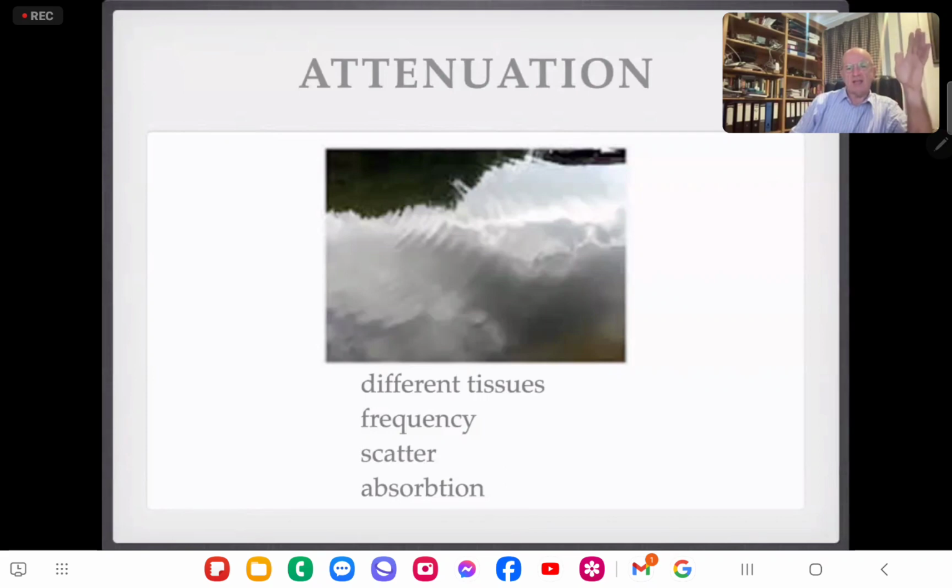So you need to recognize that when you are listening, the further away the signals come from, the more you need to turn up the volume, so you can hear them the same. So you hear bit, bit, rather than bit, bit. So that means you need a different volume at different depths. Volume, of course, is just gain. So you need to change gain by depth. So because of attenuation, you need different gains at different depths.